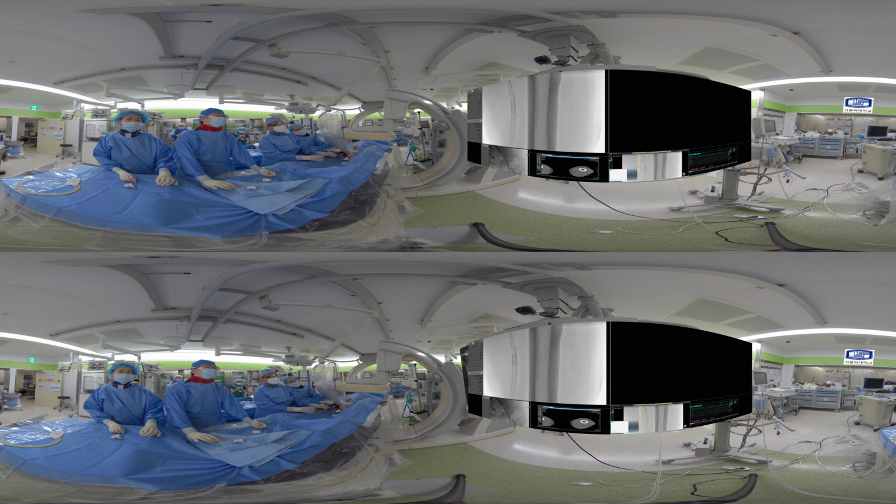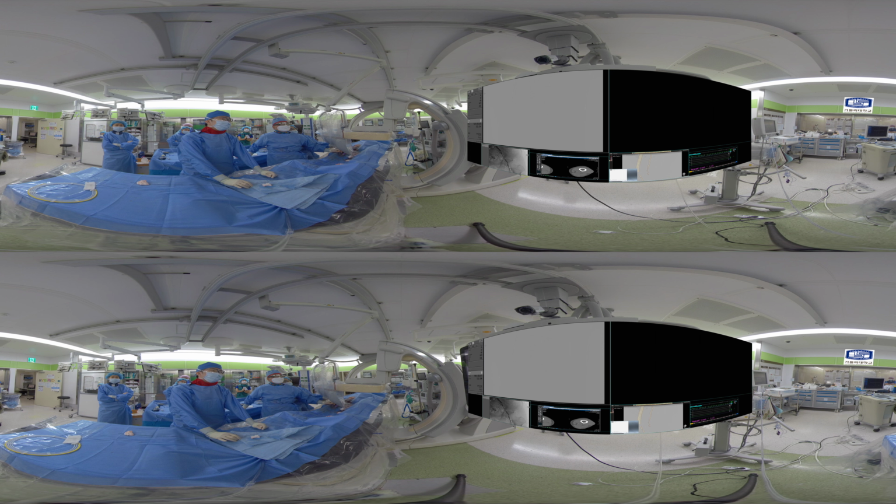An angled catheter and curved Terumo glide wire were used for engaging the CTO stump and were advanced to the distal SFA with Rubicon CTO catheter support.